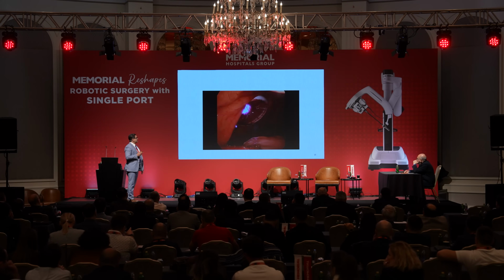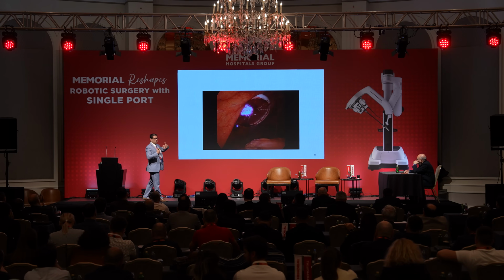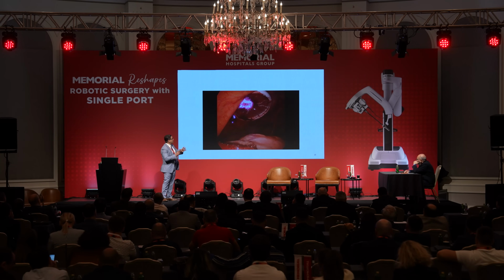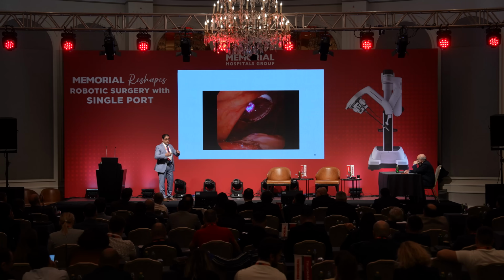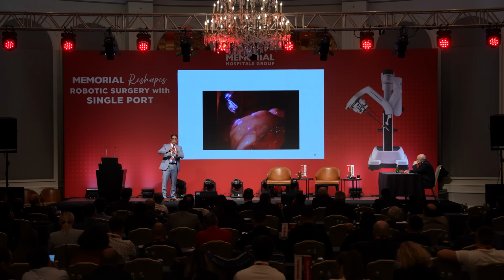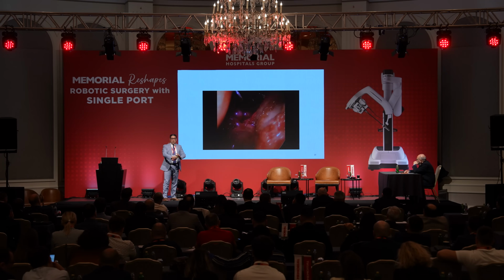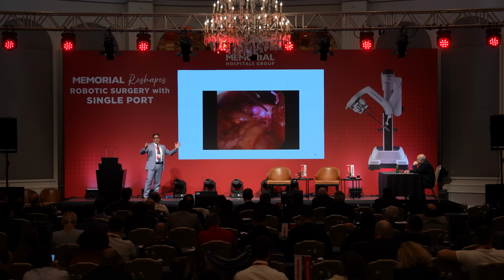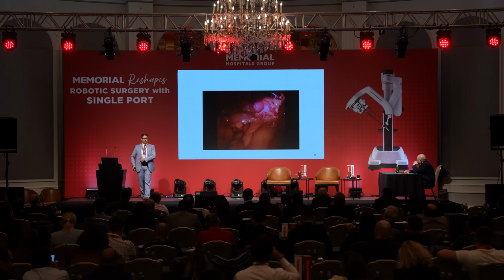Now I'm recording myself. One of the things that I had to learn with my team is how to go in. We are a little bit going, and one arm will catch the abdominal wall. Number two, which I'm going to show you in another video, is it has to be in line with your quadrant. Otherwise, the camera and the arms are going to start lifting on the abdominal wall, and that will cause trauma. The patient will wake up and will tell you, I'm fine, but I have pain here, nagging pain here, which is muscular trauma.